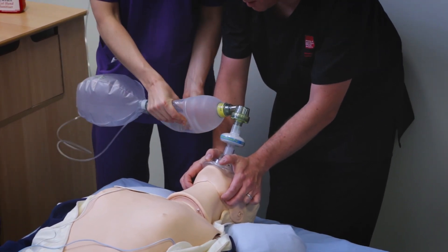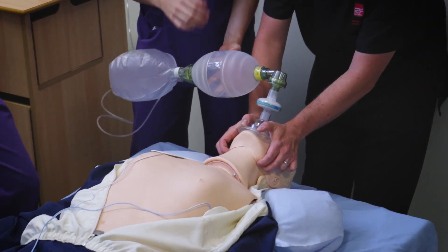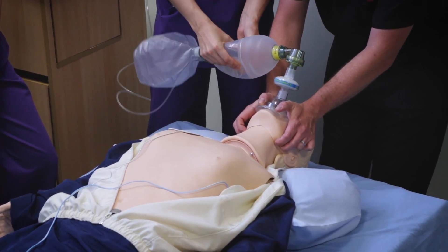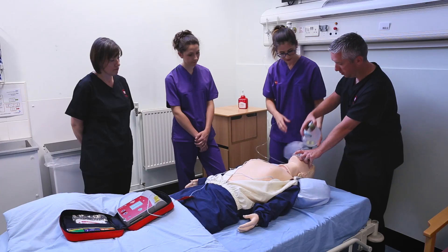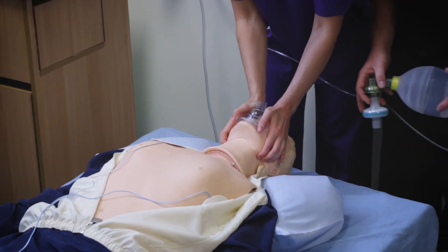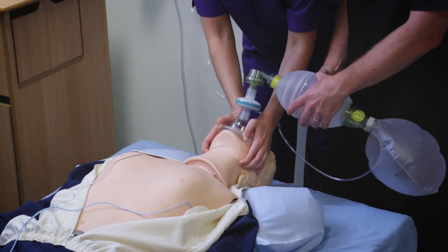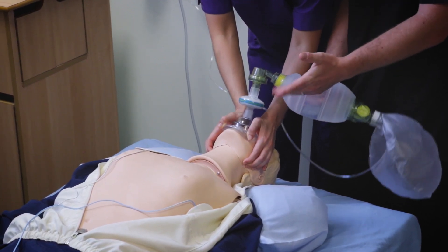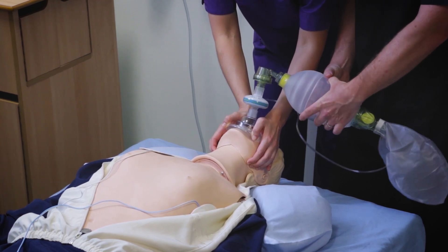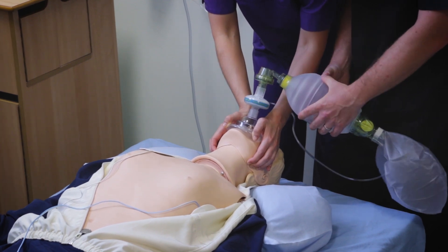Give the bag a squeeze — just enough for a chest raise. You don't need to use the whole bag. That's when you know you've got a decent airway: you can see the chest raise quite easily, there's not a great deal of effort in squeezing the bag, and there are no noises coming from the airway either.